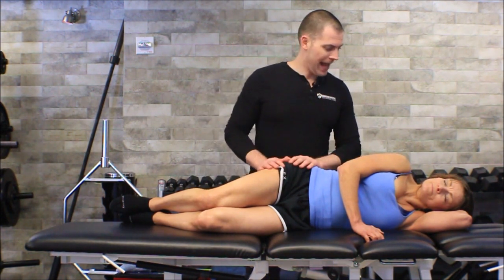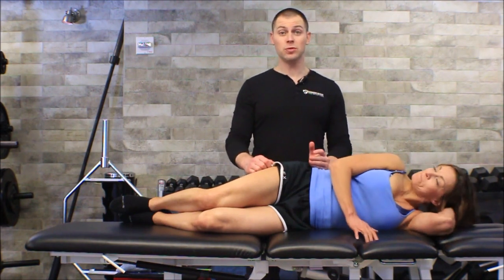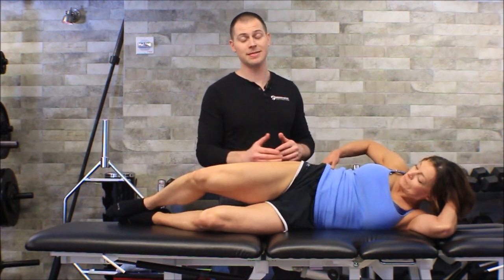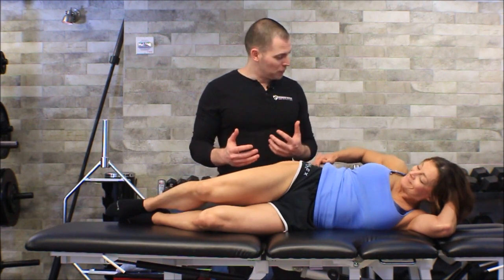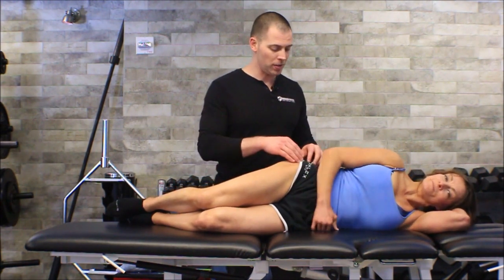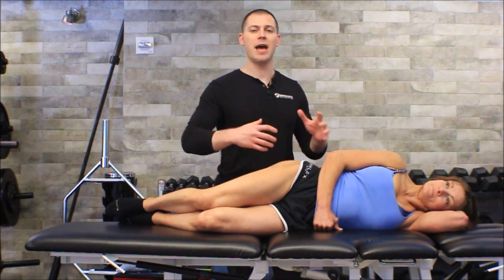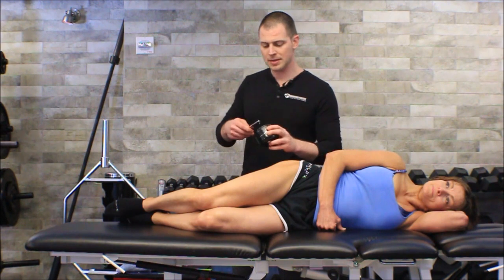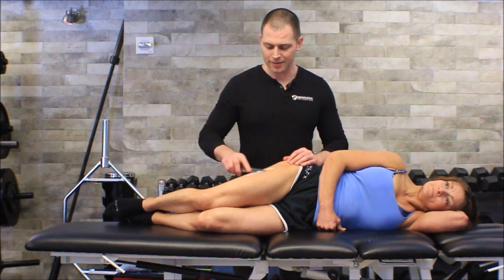First we need to get access to all of the fasciolata, which ends at the iliac crest, so you'll notice I have Lisa in some loose shorts. Loose shorts are helpful for these techniques — they do need to be done on skin. A modesty tip: have your clients tuck their shorts underneath their underwear so shorts stay pinned down as you move around. We're going to grab a little bit of cream, because we want to do this as a fascial technique, not just abrade and mess with the skin.